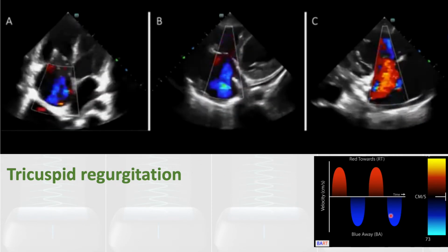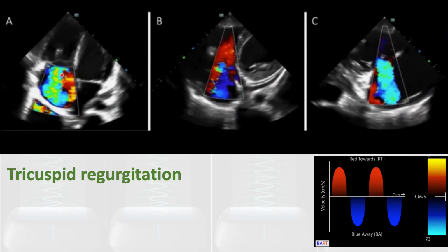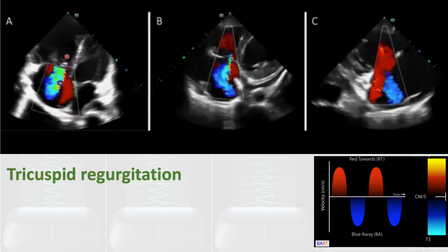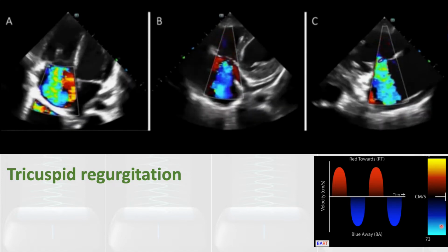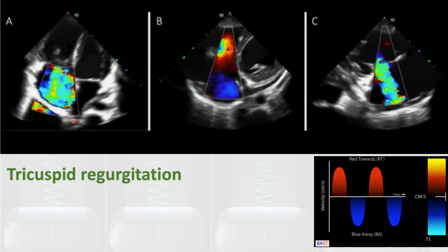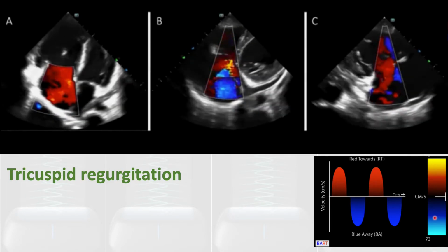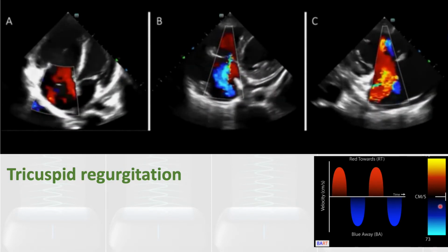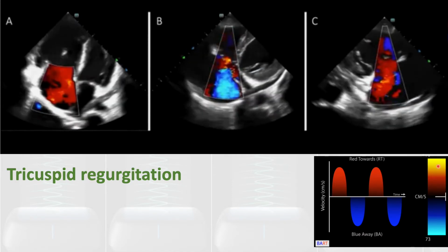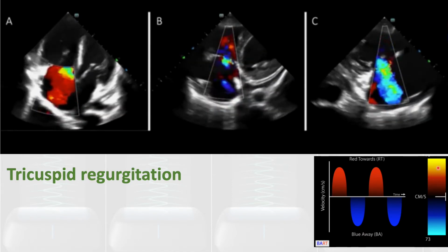technique, as you know, in the Doppler technique you're asking the ultrasound device to detect the motion of blood flow. Any motion that's away from the probe, the probe is here, any motion away from the probe will be indicated by a blue color, and any movement towards the probe will be indicated by the yellow or red color.